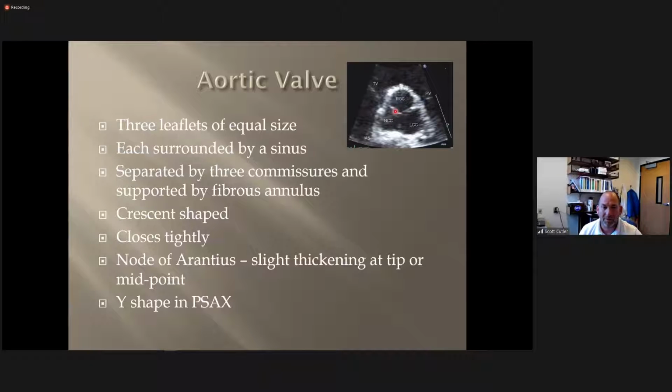Okay, right there. I always have to tell this story because I'm proud of my students that thrive in the clinical setting. As a student, someone here locally, a surgeon or a doctor, was asking a resident what that structure was. They're pointing to it, and the medical resident couldn't quite figure it out. And my student said, can I ask? Really shyly. And they said, yeah, go ahead. And my student said, is it a nodule of Arantius? And he said, yeah, you just got shown up by an echo student. It was awesome. So the little things matter.